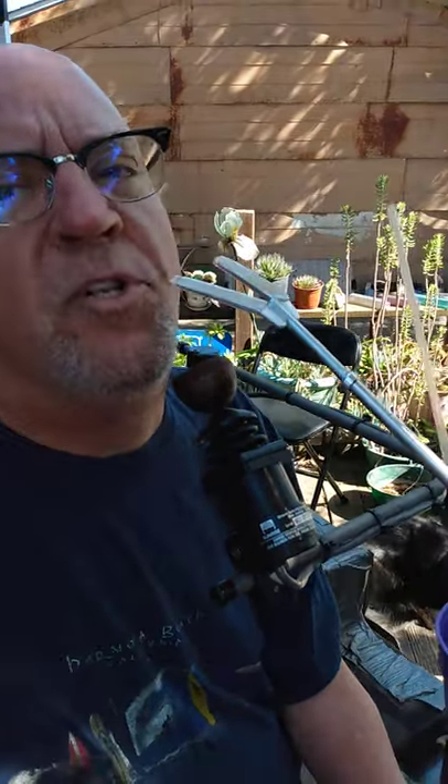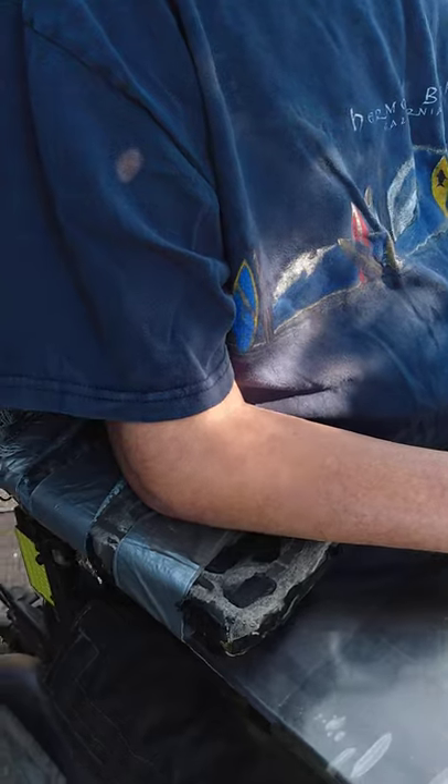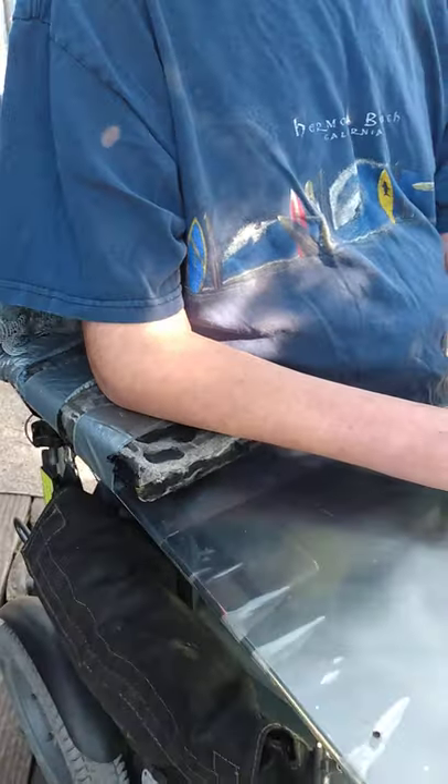The armrests on my chair support the lap board. I don't put my arms directly on the armrests — I put the lap board on the armrests and my arms on the lap board. They are adjustable in height, though once set to the right position, in my case they typically aren't adjusted further.